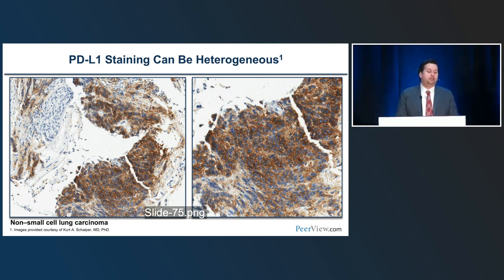And this is, again, to show that it doesn't always look membranous. You can see here that it looks membranous plus something else. So this can be challenging because discerning how many of these cells are actually membranous from the ones that are not can be tricky, but you have to do your best call.